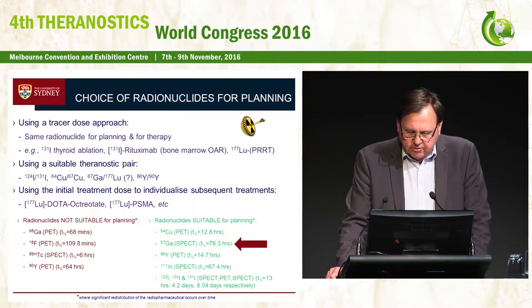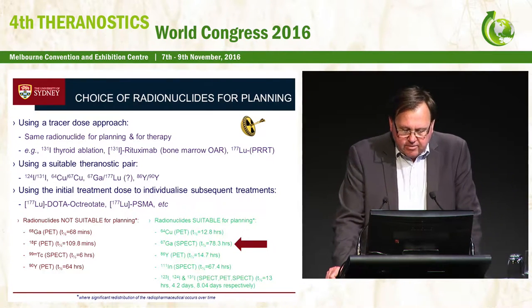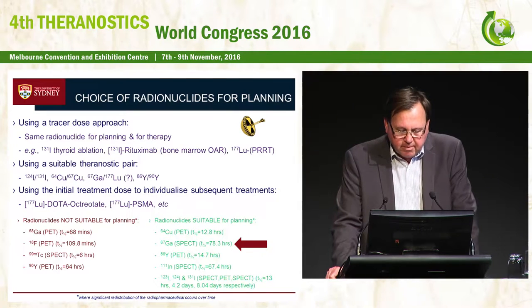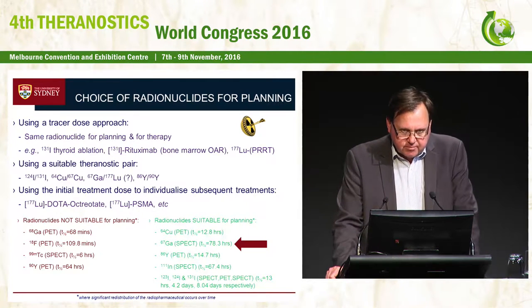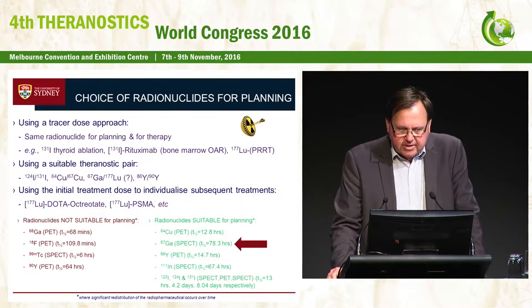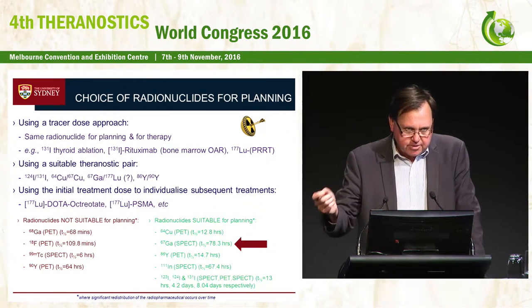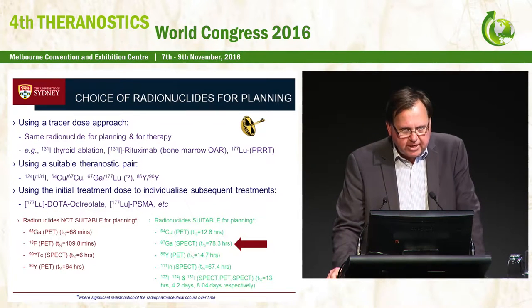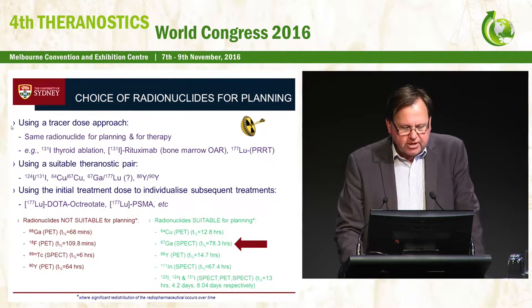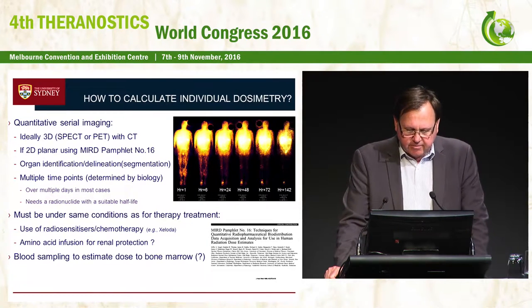We've done some work recently imaging the upper two peaks that we conventionally image with in nuclear medicine, neglecting the lower one at 93 keV, and you still can get very excellent image quality. And you can also do it simultaneously with technetium on board, so the gamma camera's energy resolution has the ability to separate those. So I think you can substitute gallium-67 where you might use gallium-68, say on a DOTATATE molecule. I think that could make it potentially attractive if you wanted to use the tracer dose approach to planning a therapy. So something perhaps to think about going forward. And we've certainly made some gallium-67 DOTATATE in our institution.